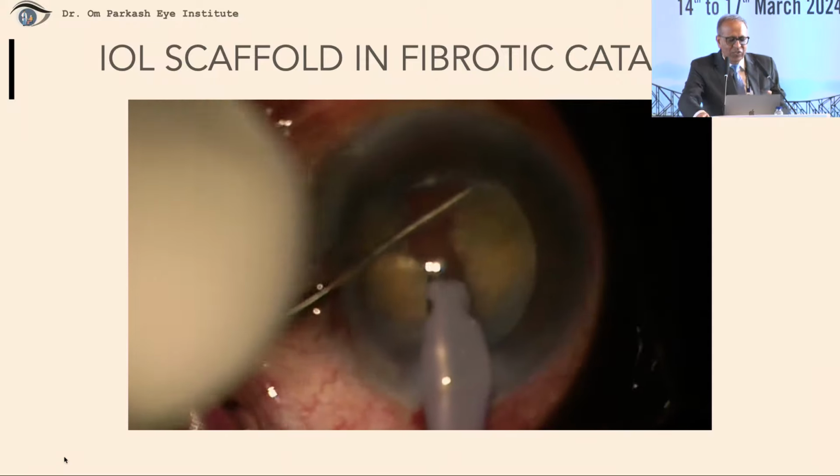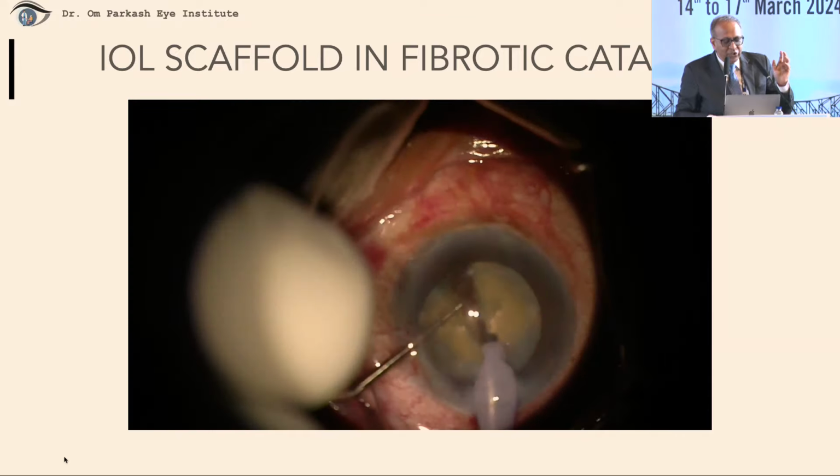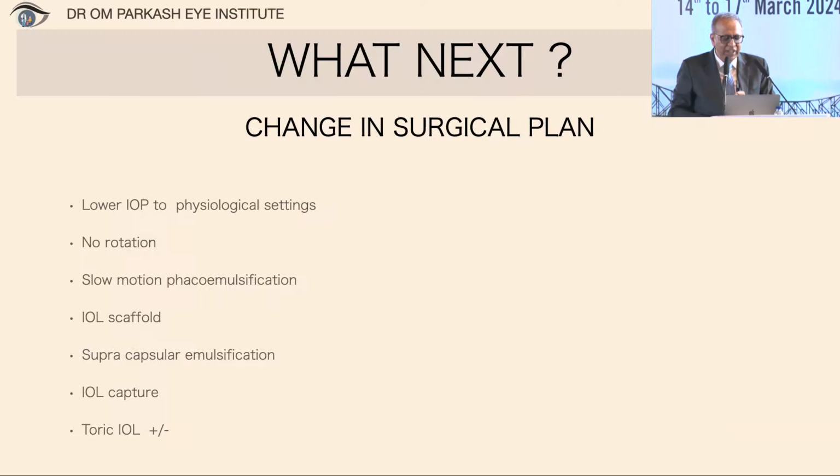This could have been the cause in the second eye, where he had an optic capture, and this posterior capsule rupture shows that there was a pre-existing defect.